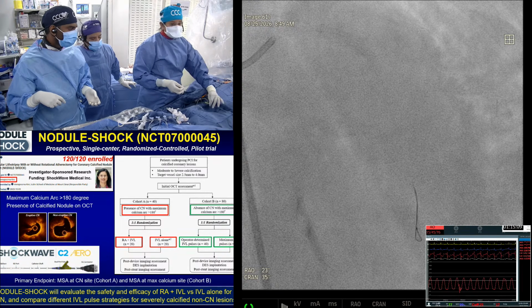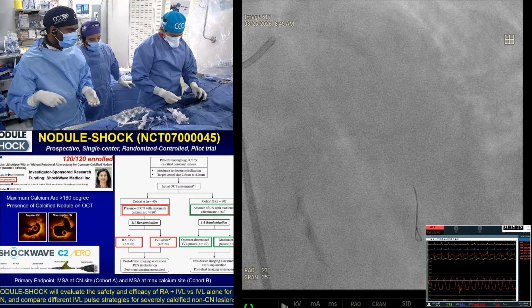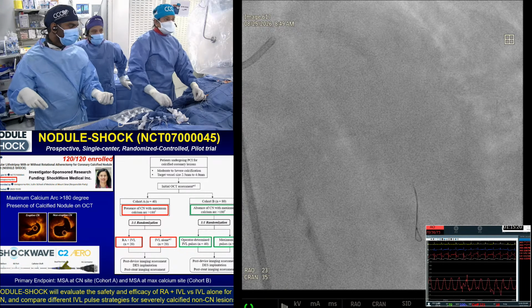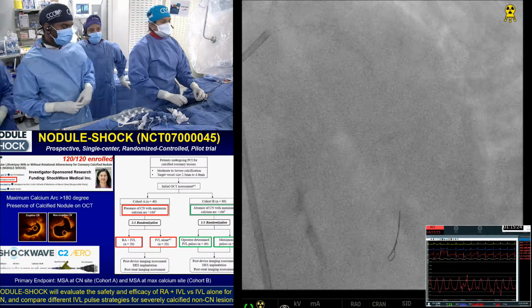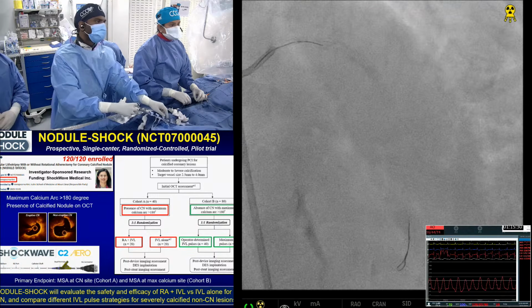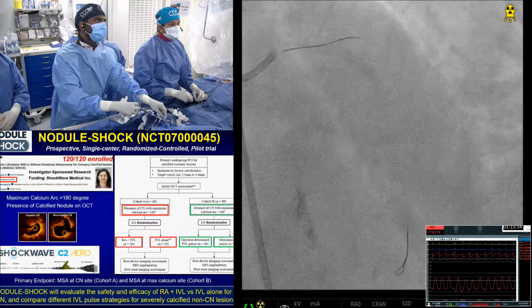Because of the EKG changes, just looking at lead 3, that would probably suggest a circ, no? But circ flow was looking very good. You're right, it will tell you that maybe that's the case, but not in this case. We have seen the circ. It's going to the circ easily.